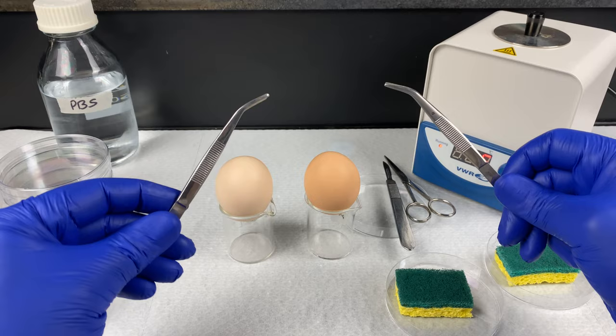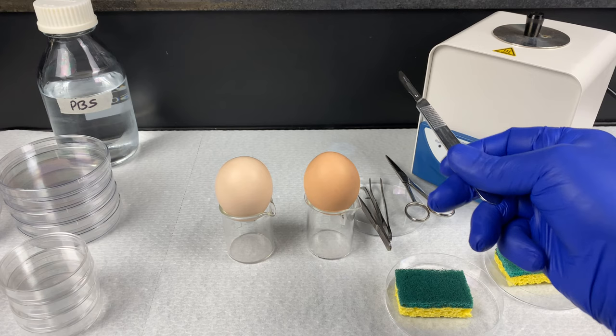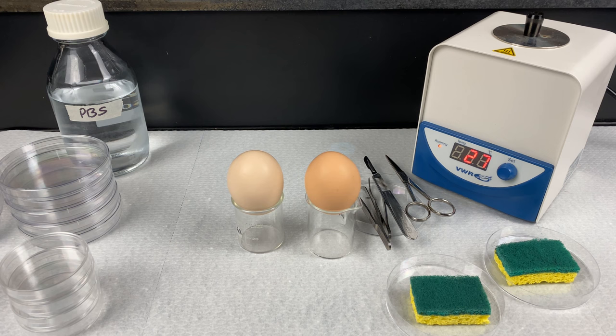We are going to be using a pair of scissors to crack the egg open, two pairs of curved forceps, and a scalpel — a disposable blade in the handle. Note: this is the sharp side; don't poke yourself. In a previous video named Step 1, I have gone through the setup of a lot of this already. If you haven't done so yet, please watch that video and then come back and watch this one.